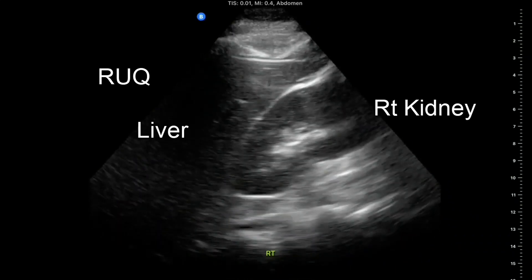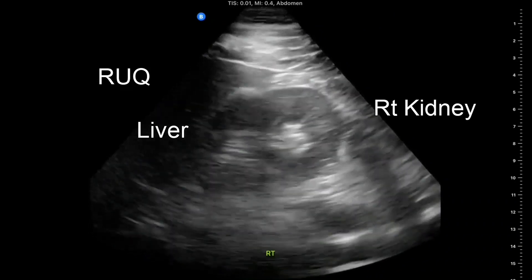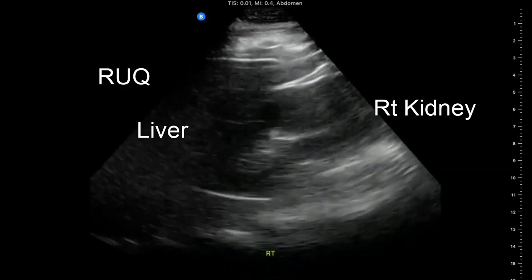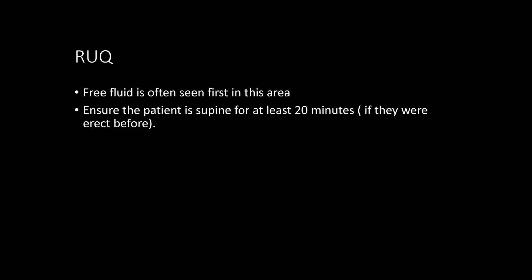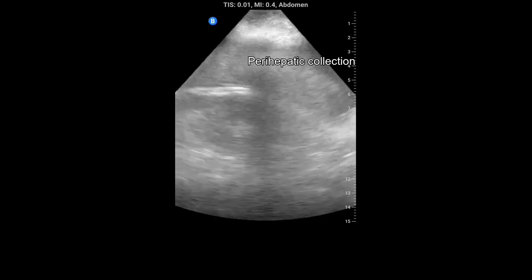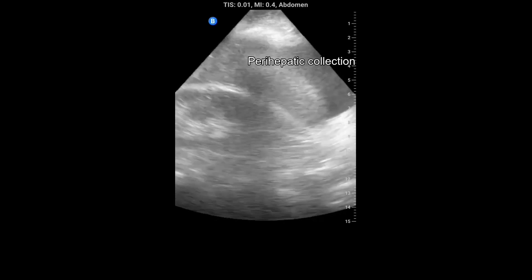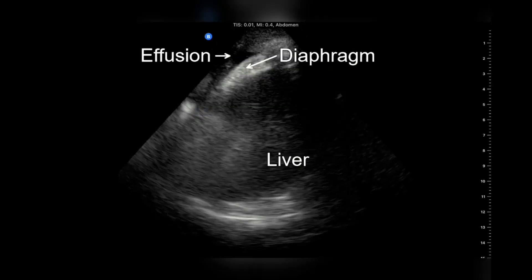Moving the transducer caudad brings the inferior pole of the kidney and the superior aspect of the right paracolic gutter into view. The majority of peritoneal fluid collections are detected in the perihepatic region. Make sure the patient is supine for at least 20 minutes. Free fluid in the hepatorenal space or Morrison's pouch is bordered by Glisson's capsule of the liver and Gerota's fascia of the right kidney.